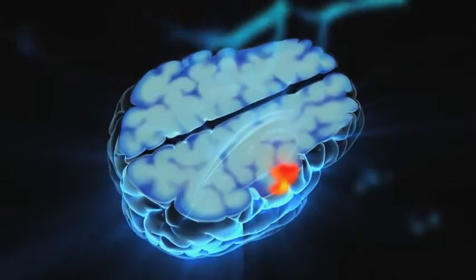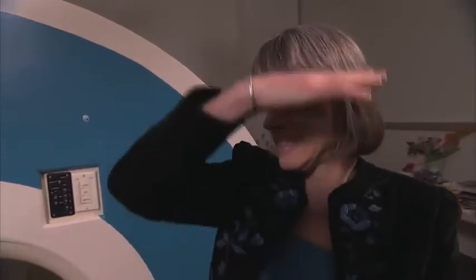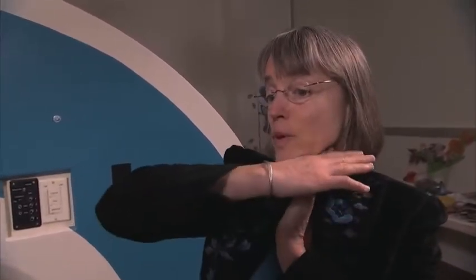Your brain is a three-dimensional object, and we take pictures of it by making a series of slices, for example, like this. So we might choose, if we want to cover your whole brain, a series of 20 horizontal slices like this. And then within each slice, we have a nice 2D picture of what's going on in that slice.